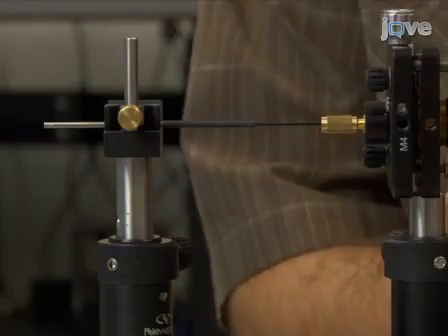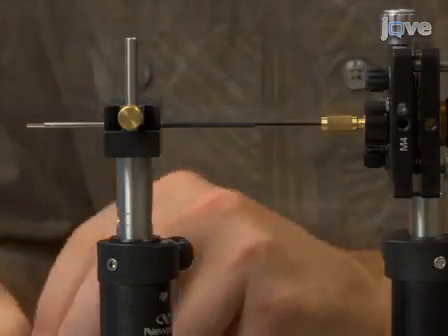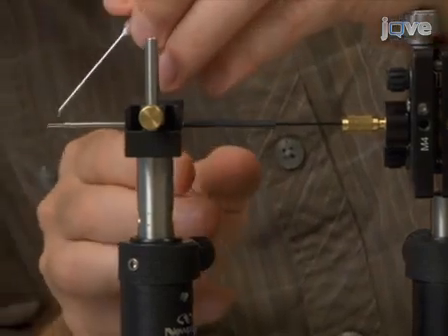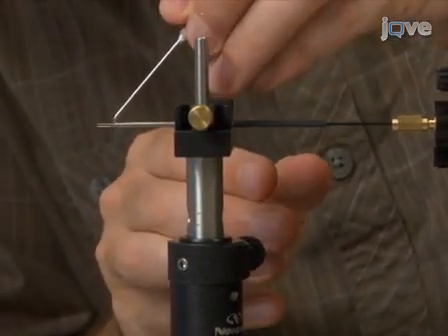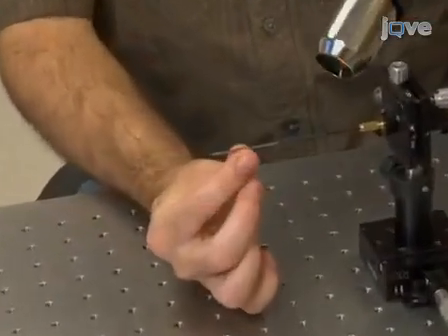To protect the Grin lens and the bonded interface, use a short length of aluminium capillary tubing to enclose the joint. Slide the tubing over the joint and secure in place with a drop of epoxy at each end of the tubing. Use heat shrink tubing to finish the assembly.